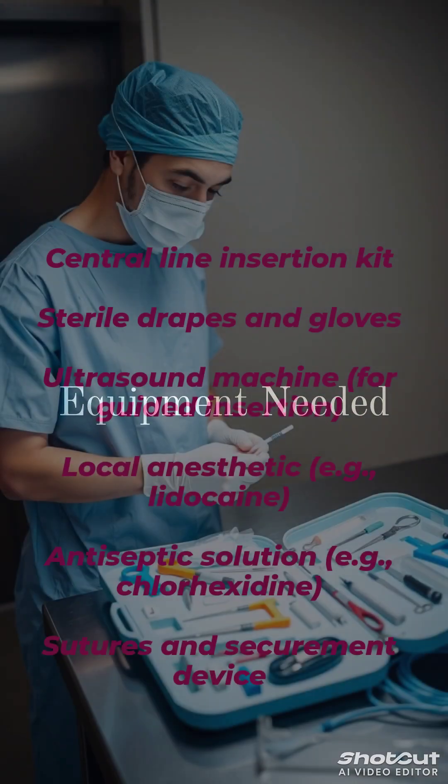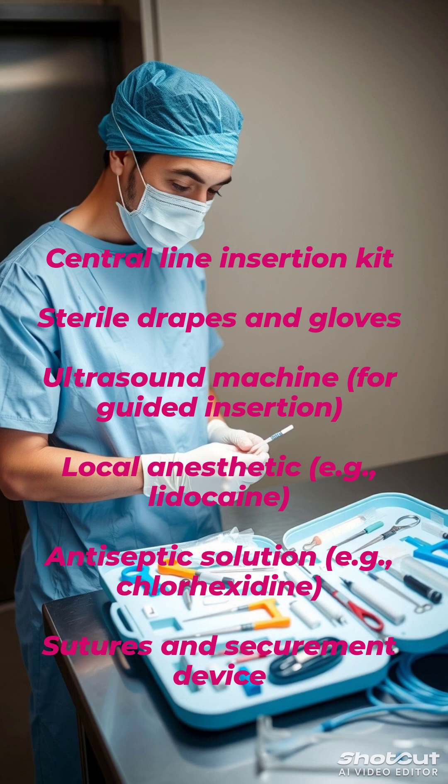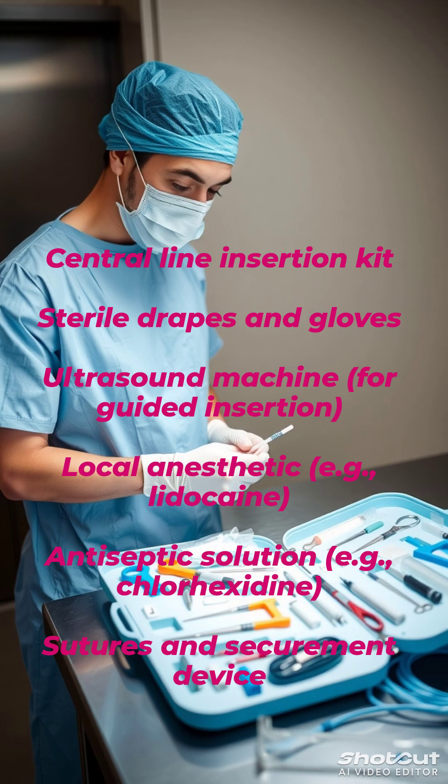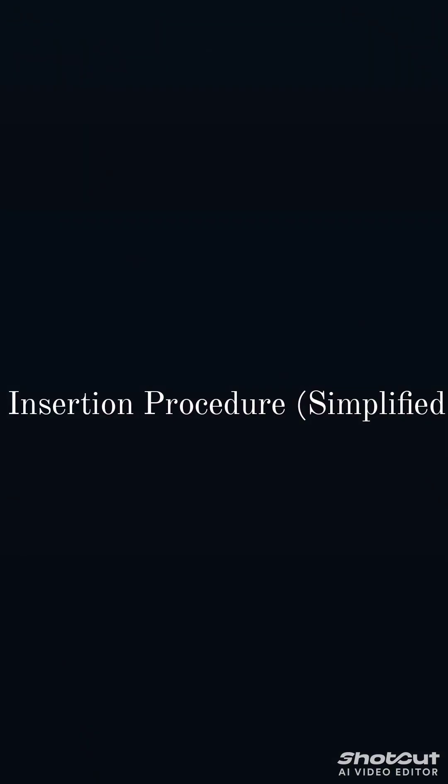Equipment needed: Central line insertion kit, sterile drapes and gloves, ultrasound machine for guided insertion, local anesthetic e.g. lidocaine, antiseptic solution e.g. chlorhexidine, sutures, and securement device.